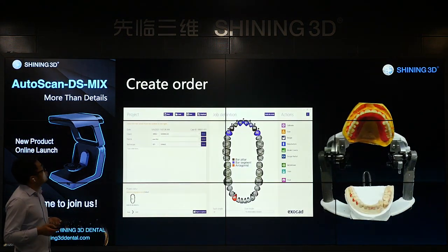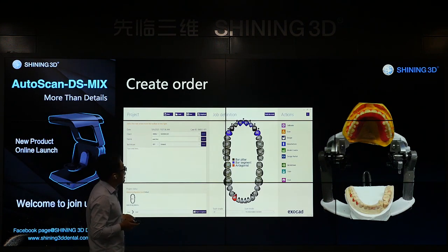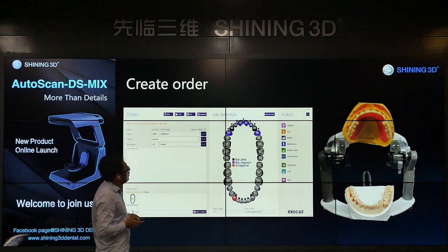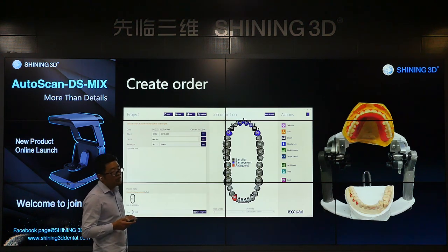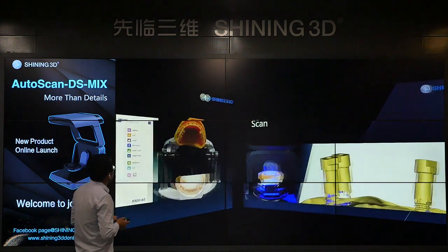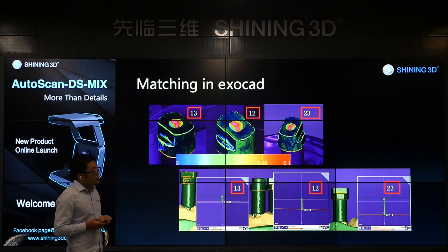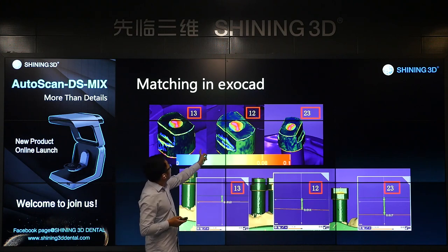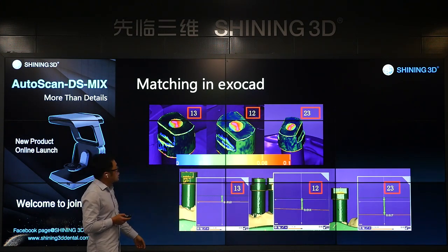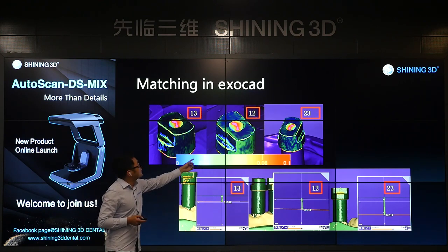So first, we need to create order for the bar. 12, 13, 23 is bar attachment. 14, 11, 21, 22, and 24 is bar segment. 43, antagonist. See, we need to scan the scan body with DS-MIX. Here is the result of the merging effect. We can check the contour of the bar. 13, 12, and 23, and all the figures are less than 0.02. You can see the color is blue.